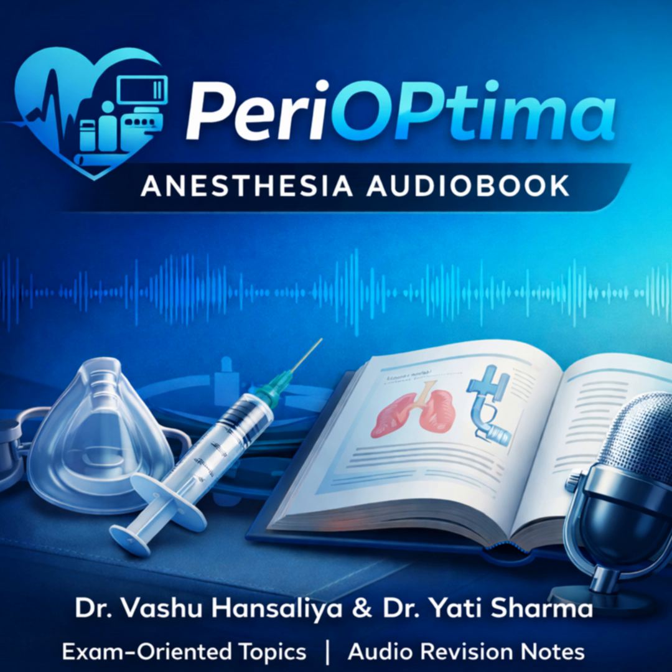Let's move to section 3 and unpack the physiology. This is the exam gold. If you get a 20 marker, this is where you're going to score the majority of your points. It is. And when you write this answer, you need to break it down into 2 key headers. This shows the examiner you understand the logic: diastolic augmentation and systolic unloading. This framework directly addresses the supply versus demand equation of the heart. Perfect. Let's unpack diastolic augmentation first.